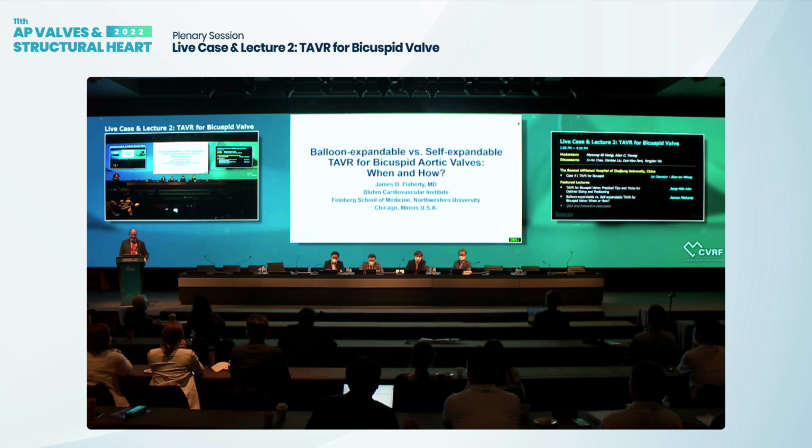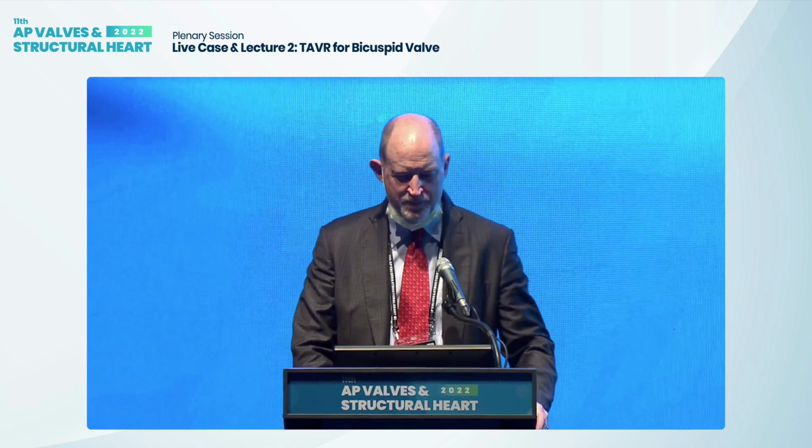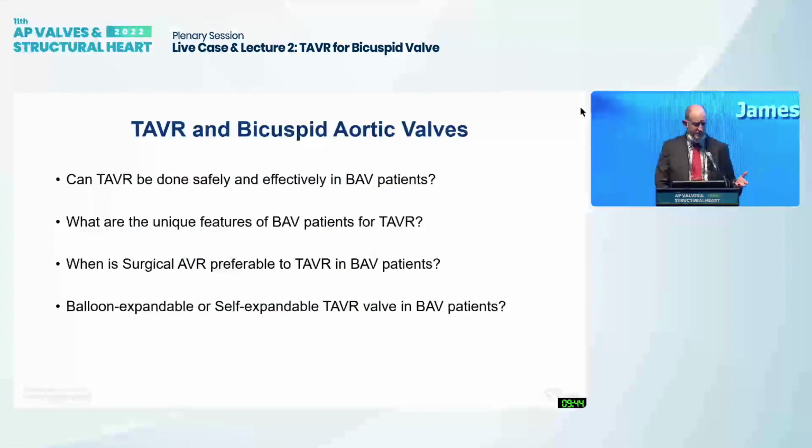I'm going to expand a little bit on what Dr. Ahn just covered. I have nothing to disclose. He covered some of the unique features about the bicuspid aortic valve and how to incorporate that in your decision making.